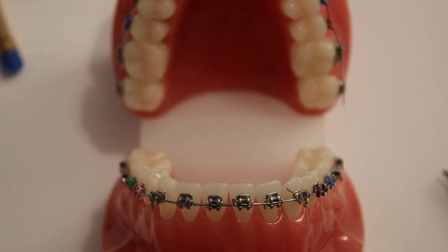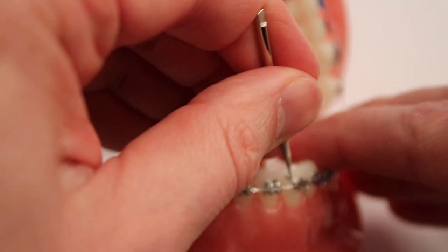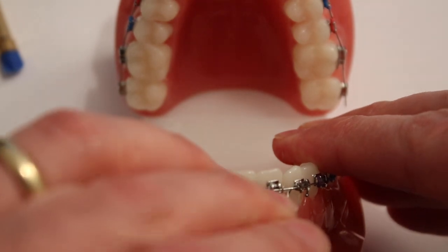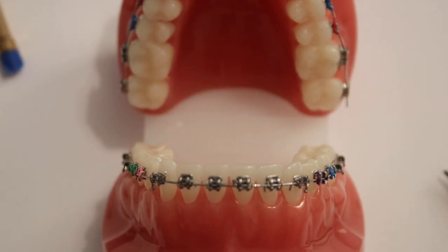Whatever you use, the implement needs to be stiff enough to push the metal wire back under the bracket without bending. You may need a family member to do this for you, or help pull your lip or cheek away from where you're working, to ensure you perform this safely.